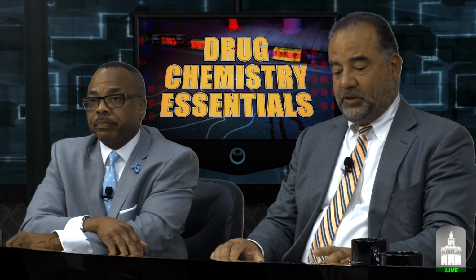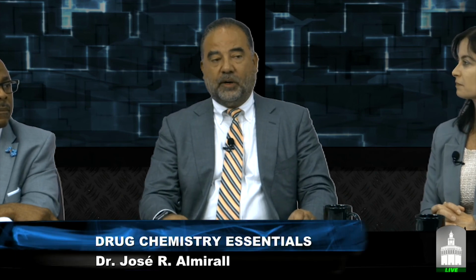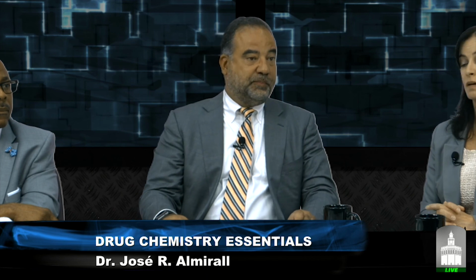And the other question that's on the chat now is, are the lab errors documented? Yes, there is a procedure within the accreditation process that when lab errors do occur, for example, proficiency tests, all forensic scientists undergo proficiency testing. If they have committed an error in a proficiency test, that sets into motion a series of events, including documentation, remedial work, and more training. So there are mechanisms in place.